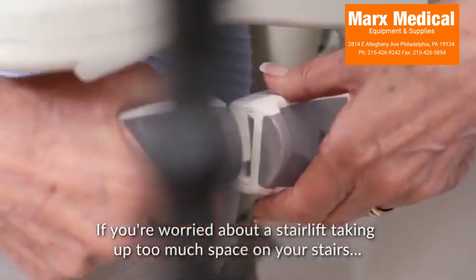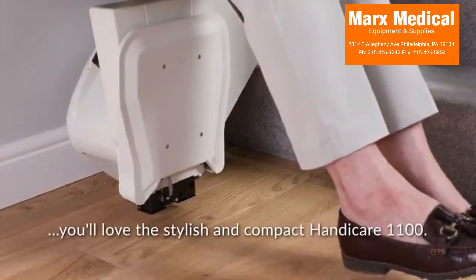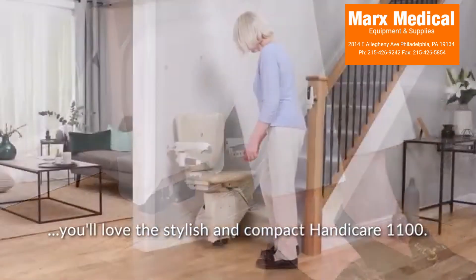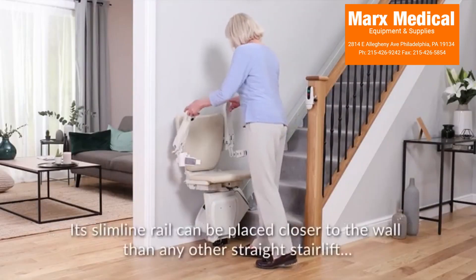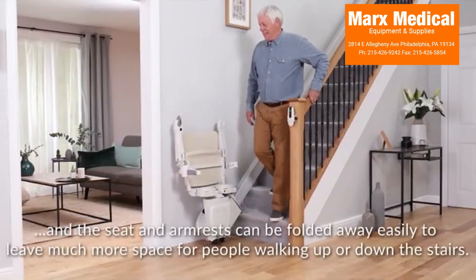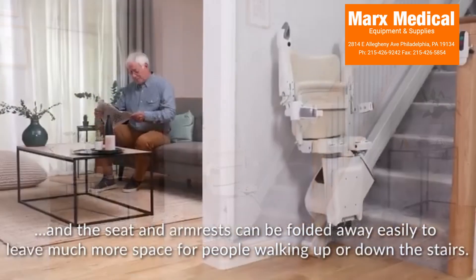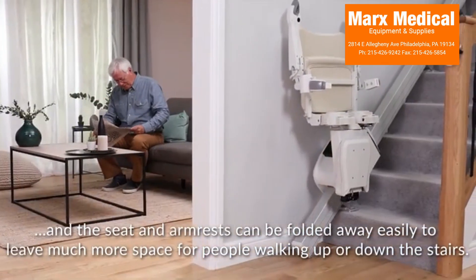If you're worried about a stair lift taking up too much space on your stairs, you'll love the stylish and compact Handicare 1100. Its slimline rail can be placed closer to the wall than any other straight stair lift. The seat and armrest can be folded away easily to leave much more space for people walking up or down the stairs.